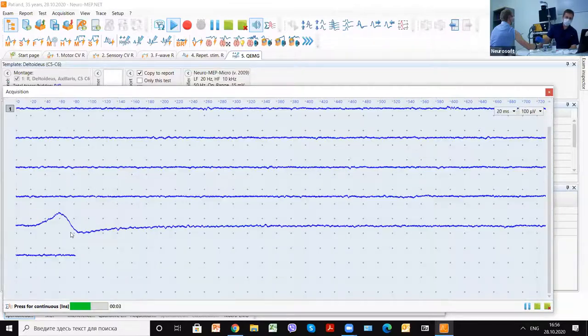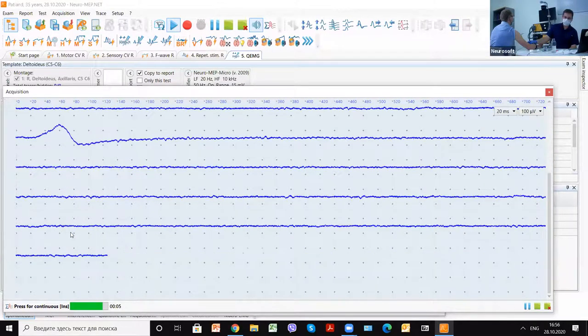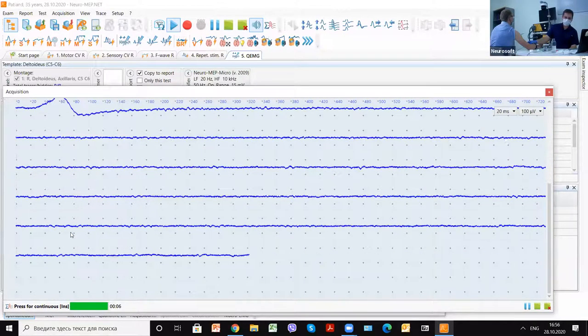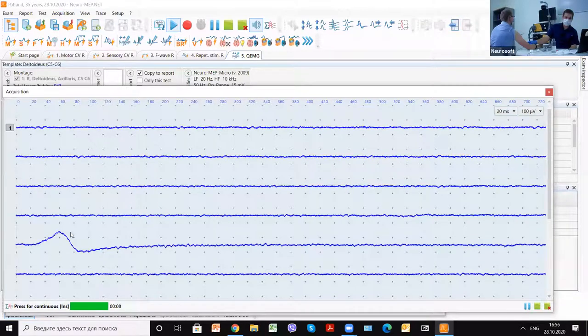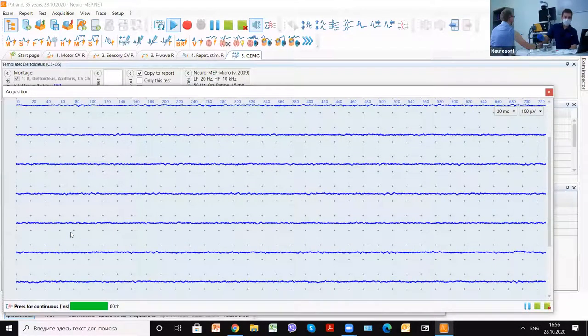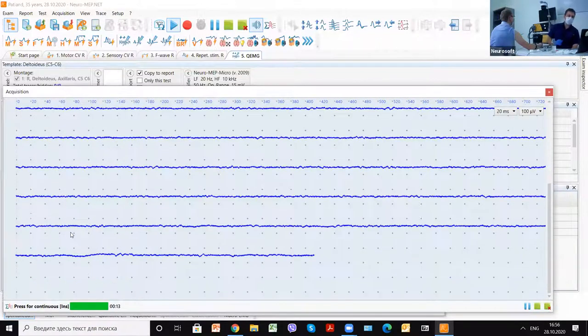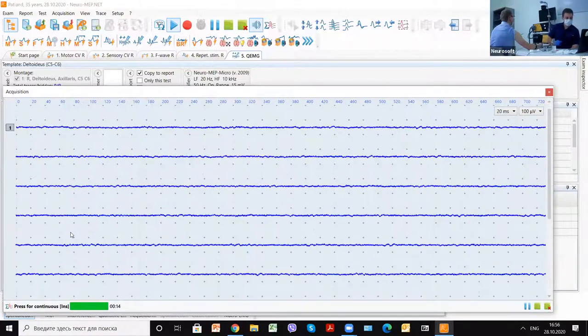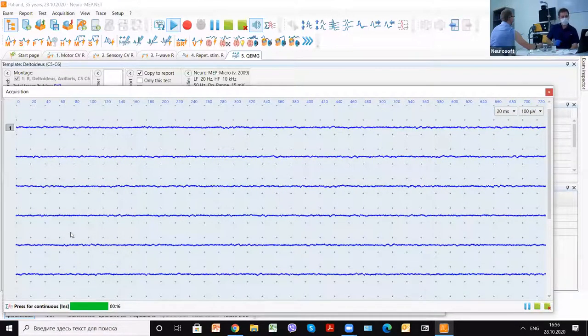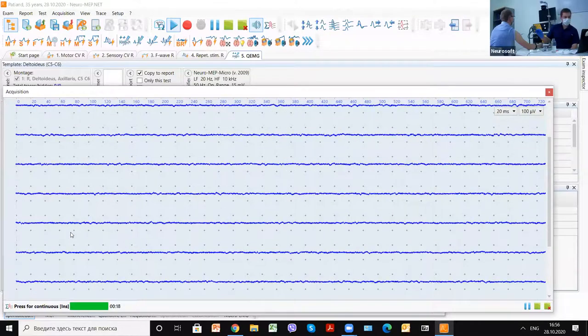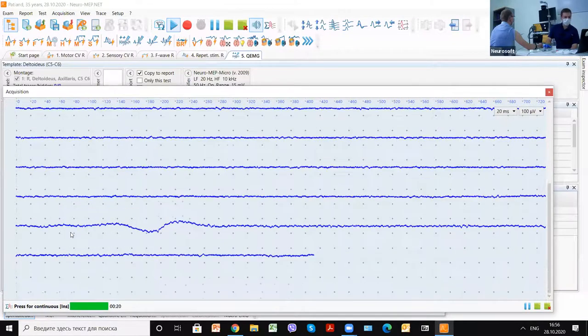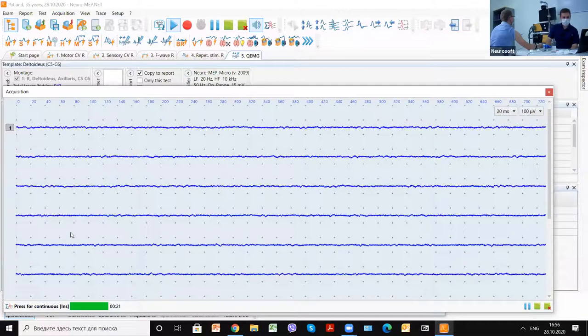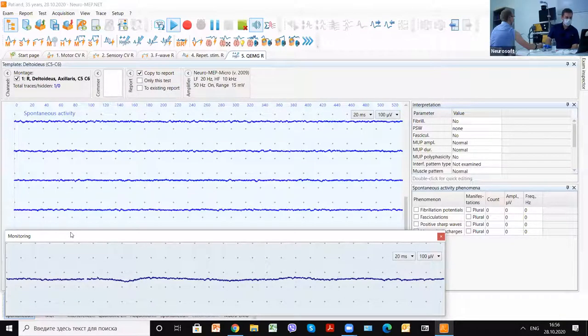We can relax a little bit more. We continue looking for the spontaneous activity in this position of the needle. We don't have any spontaneous activity registered.